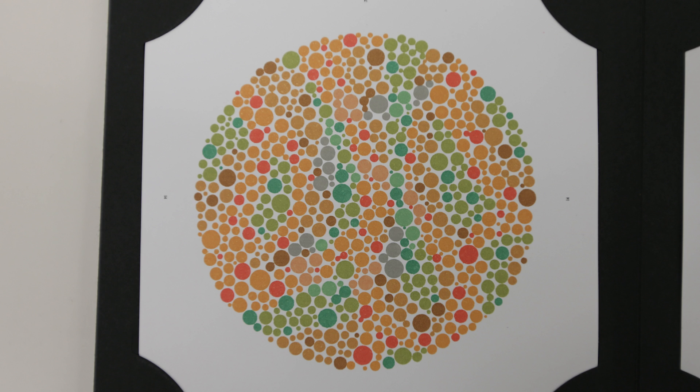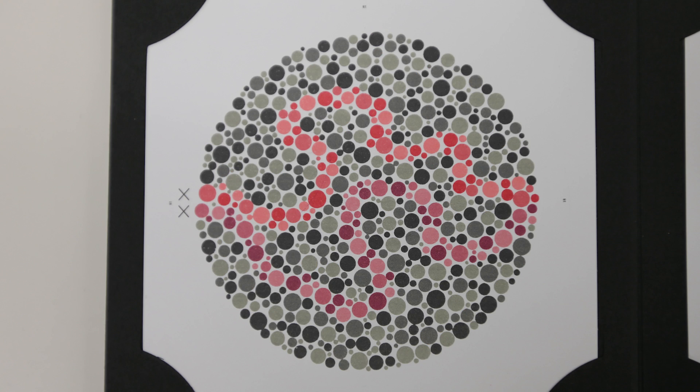Here we are at plates 14 and 15, which are a hidden digit design. Normal vision people can't see anything, but people with a color deficit will be able to see something. As usual, I'm going to leave it to you to decide what you can see — this is plate number 14 that we're looking at. And lastly, once you've gone through those first 17 plates, we arrive at the classification plates, which are plates 18 to 24.